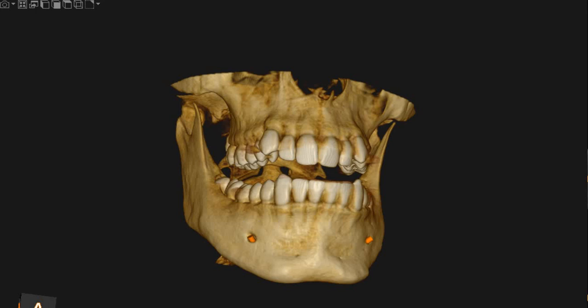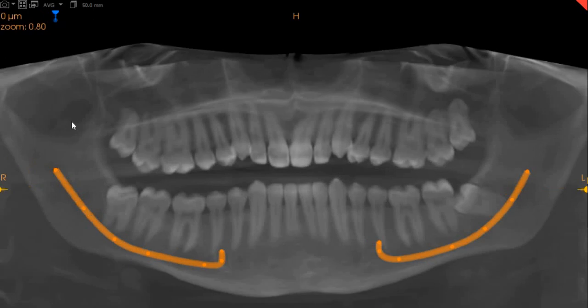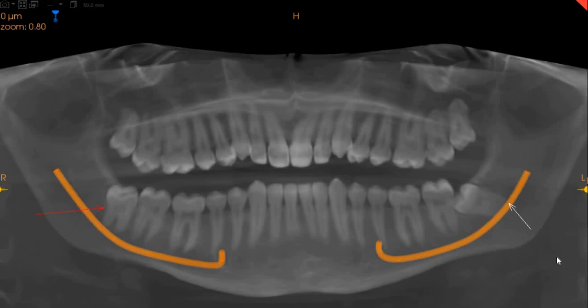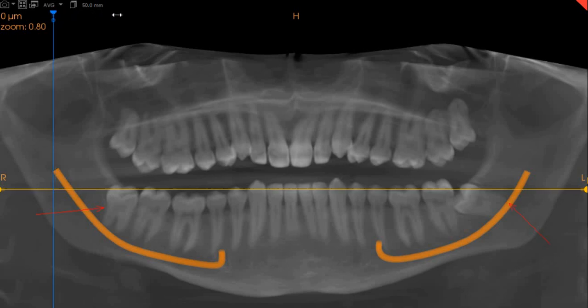Assalamu alaikum. Ultrascan Diagnostics here. This is the CBCT of the patient that you had requested. The area of interest is the lower right and the lower left wisdom teeth and their affiliation and association with the inferior alveolar nerve.